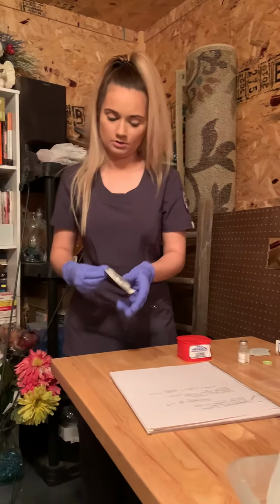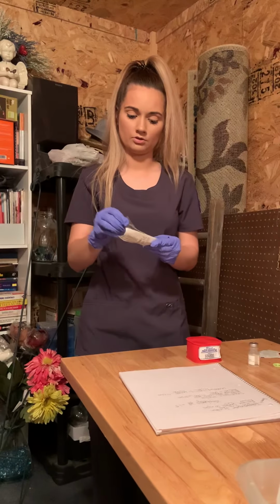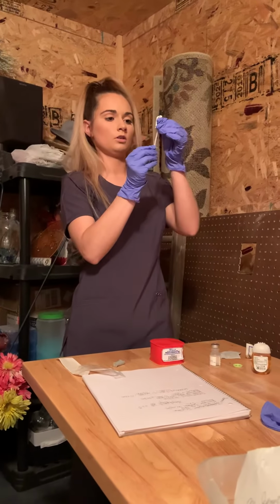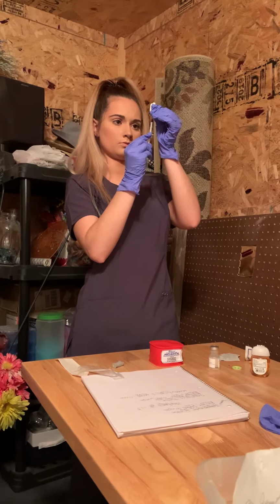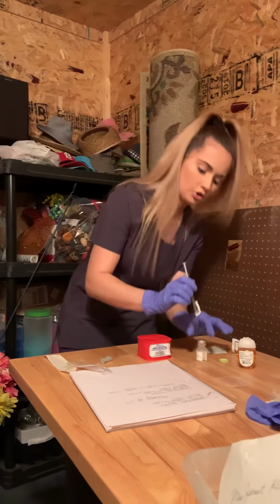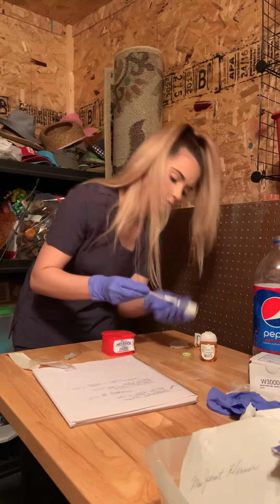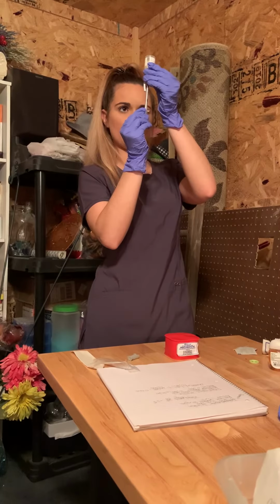Now with this injection, you do not have a blunt tip. The needle is already attached. So you want to take the needle off, go to your correct dosage that you need. You want to insert the needle into your vial and inject the air in. Turn your vial upside down and get the right amount of medication out.